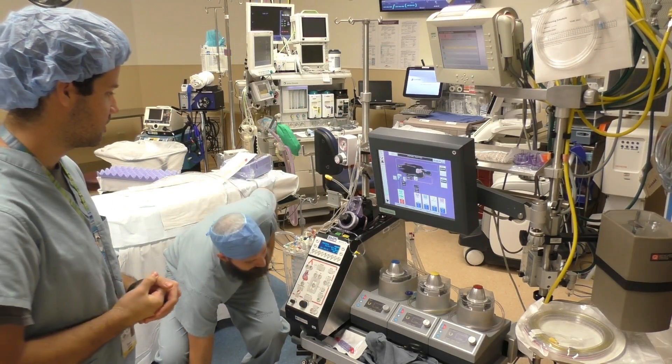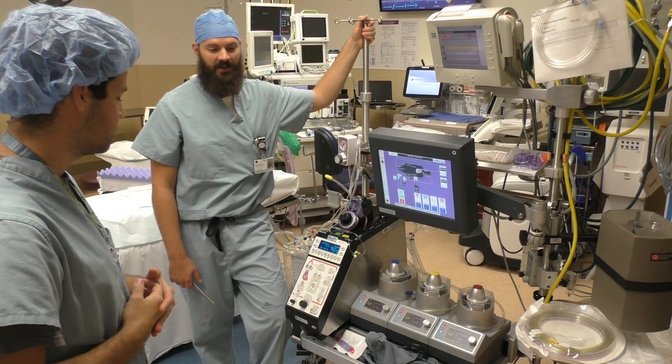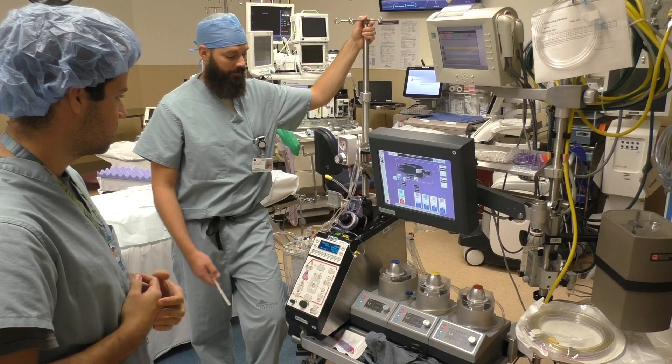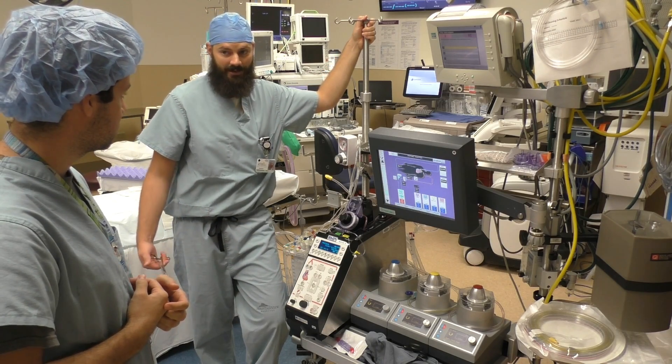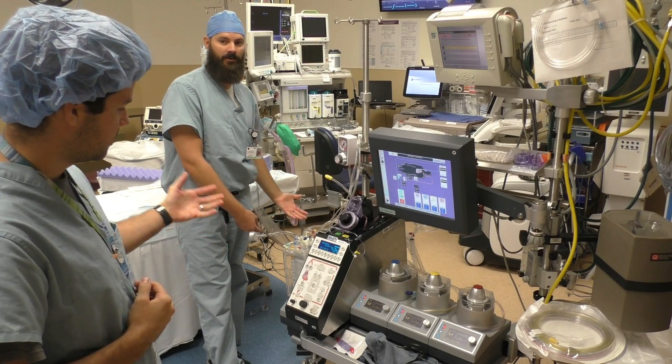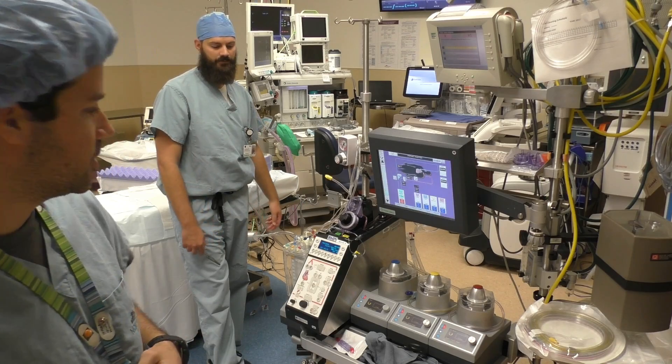It's really cool to watch, just because it's not something you get to see every day. Now the heart's completely stopped. The patient's legally dead. However, we're keeping them alive with the heart-lung machine — that is what's keeping that patient alive.